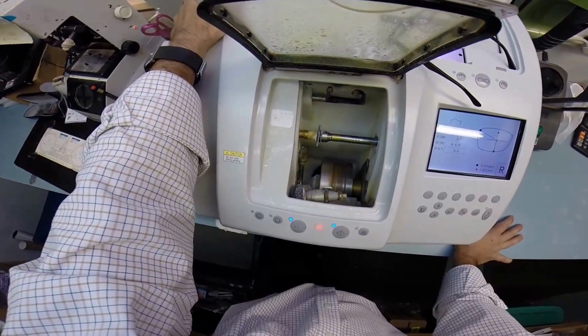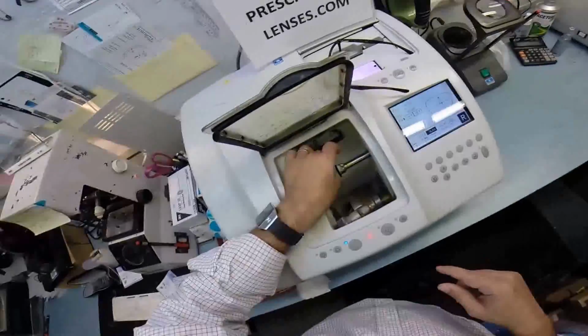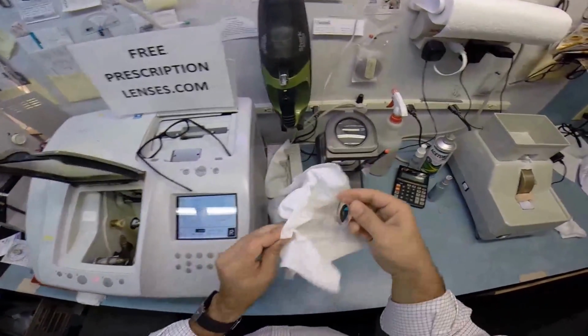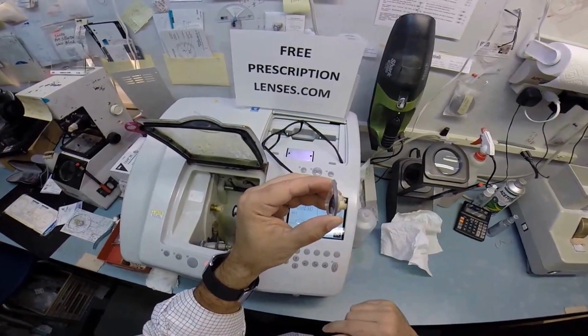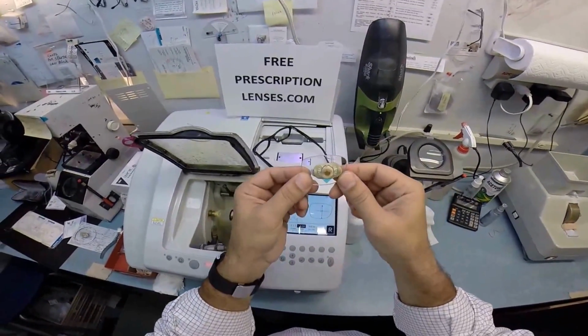Now, we did not go with the polished lens as we talked about. Anyone out there who's watching that, I'm going to tell you now, I'm not a fan of the polished edges, because especially you have an anti-glare coating to keep glare out of the front. If you polish the edge of the lens, you're just going to let glare in through the sides, and you get this weird skeleton halo effect around the edges of your lens.